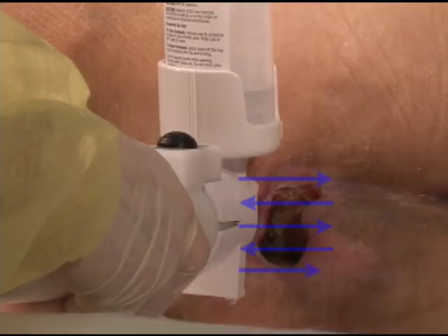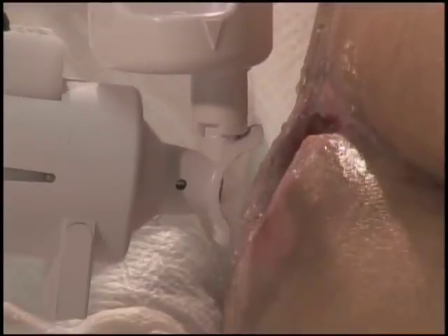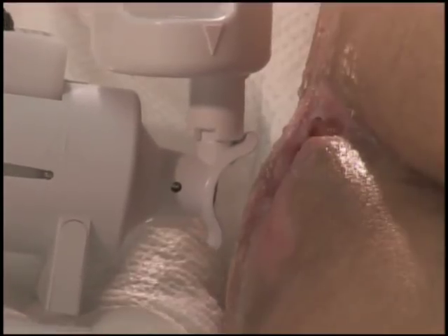To deliver mist therapy, move the treatment head horizontally across the wound using multiple passes, then vertically. The treatment head should be moved in front of the wound using slow, even strokes 0.5 to 1.5 centimeters from the wound. Intermittent, audible, and visual bubbling may occur. This is a normal response to the ultrasound waves coming in contact with the fluid in the wound bed and is a sign you are delivering the energy from the correct distance. Yet lack of this bubbling is not an indicator you are incorrectly delivering the ultrasound energy, as long as the proper distance is maintained.